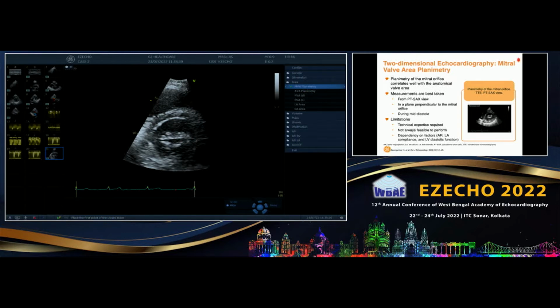This is actually called a side lobe artifact. Any very echogenic structure looks like a horizontal line. So never think that this is reality, that this calcium would be horizontal like this. A speck of calcium will always create feathers on either side. It is called side lobe artifact, and they generally go in a radial direction.